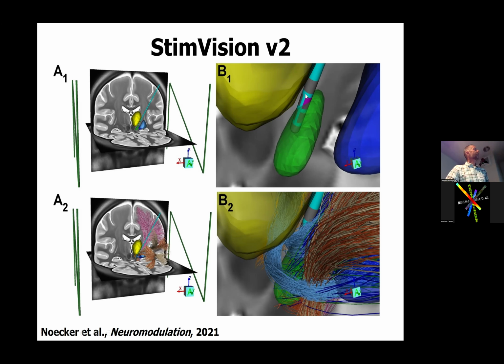So once again, if we put our electrode into patient space, we've got our STN, we stimulate through this contact, and we say, okay, we know this is the hot spot anatomically, but what does that mean in terms of this rat's nest of literally 25 different axonal pathways converging in this one little spot? So how do we do that?